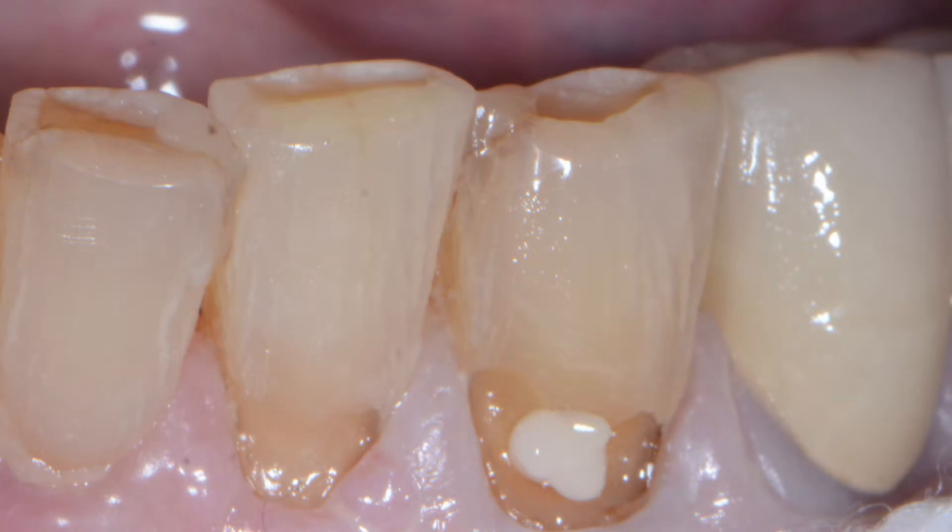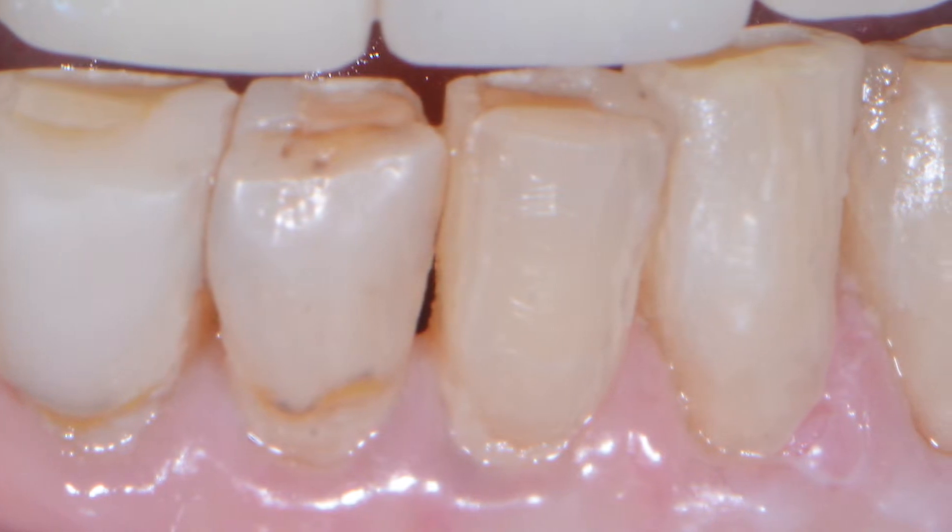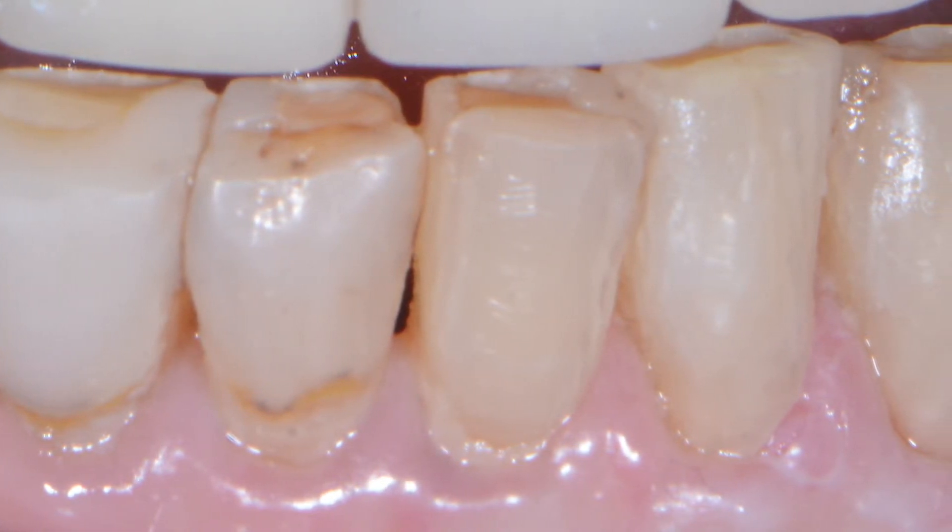As you can see from the photos here, you'll see the pre-op, you'll see the addition of the Omnichroma, and you'll see the tooth after it's been finished. These are on teeth ranging from shades A4, A5, down to B1, or even whitening shades.